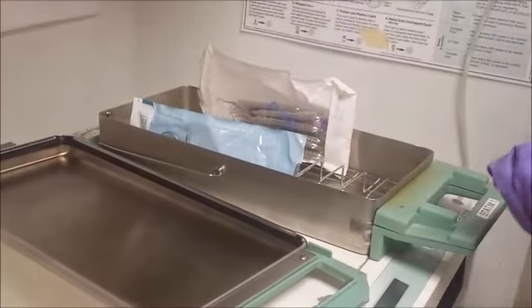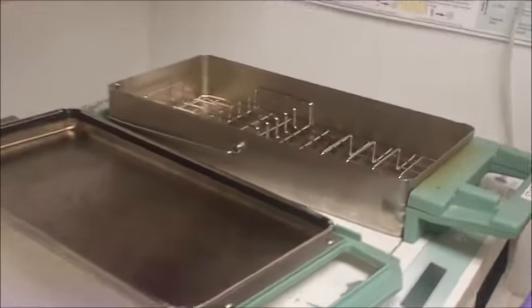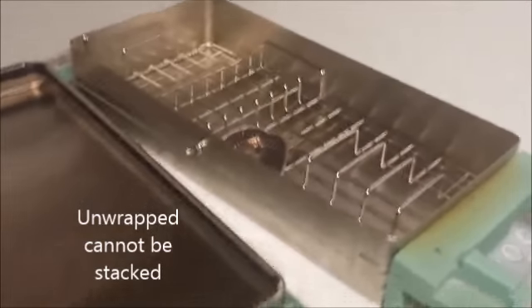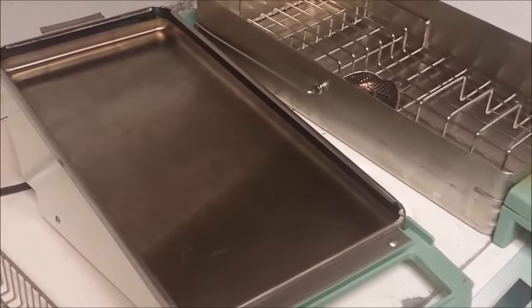For unwrapped instruments, place them in a single layer. If you have a bunch of unwrapped instruments, just make sure that they're laid evenly across and not several layers deep, or they will not achieve proper sterilization.